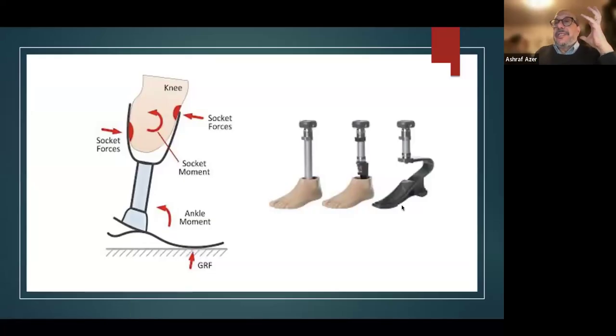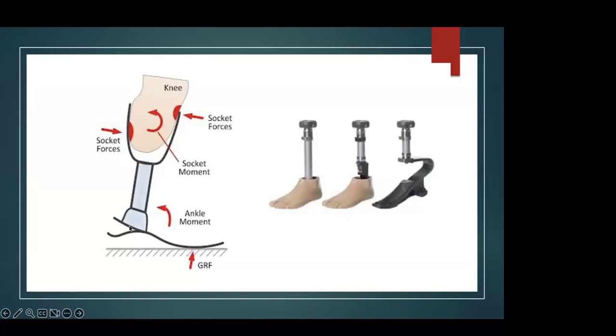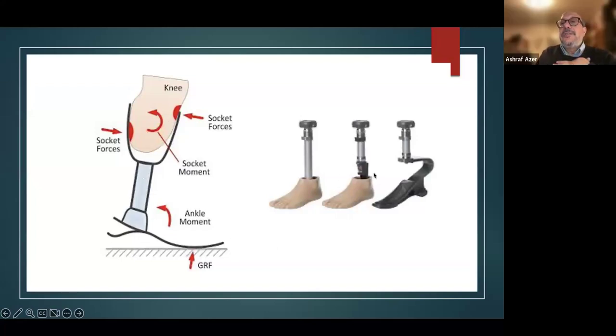If you examine a socket here, you'll see a socket. ايه هو البروسيسز? A socket, shin tube, ankle and foot. Okay, it comes in different types. So for us, it's a socket. How to move inside the socket?